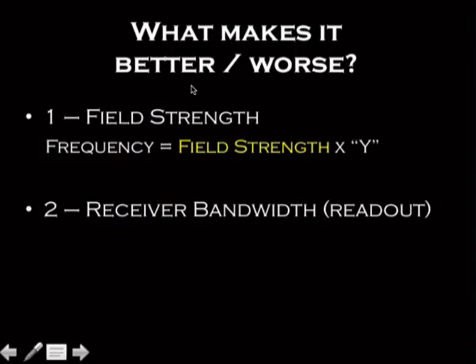So what makes it better? What makes it worse? Well, increase in field strength is going to amplify this difference. So that's going to make it worse, right? The second thing that's going to affect it is the receiver bandwidth.